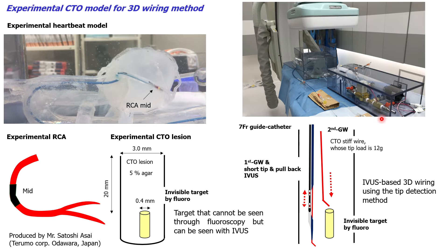I will explain the CTO origin for our IVUS-based 3D wiring using the experimental beating heart model. The CTO region is made of 5% agar, with a diameter of 3.0 millimeters and a length of 20 millimeters. An invisible target under fluoroscopy with an inner diameter of 0.4 millimeters is inserted at the distal part of the CTO region, which is then inserted into the mid-RCA of the beating heart model.